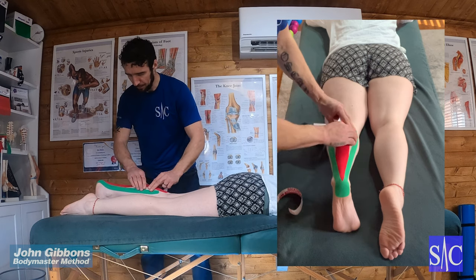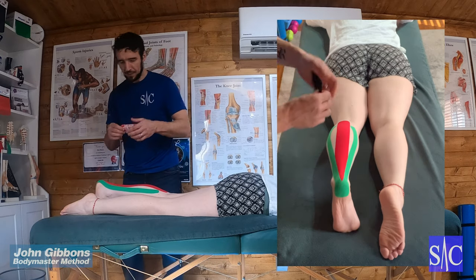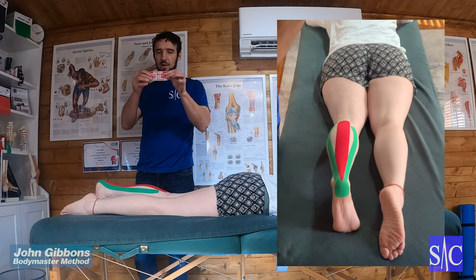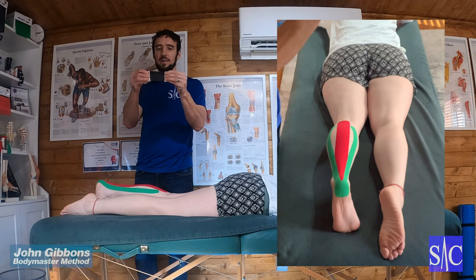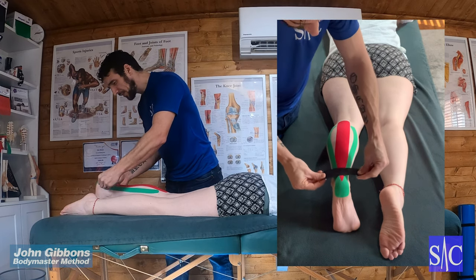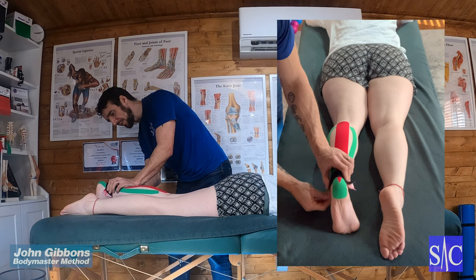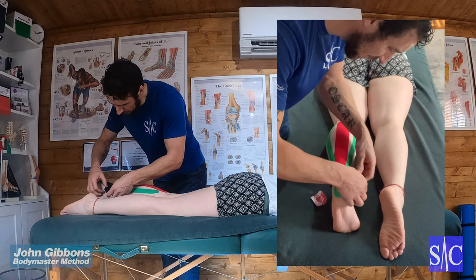For the final piece, tear straight down the middle, hold onto the ends and pull so the backing comes off. Flip it so you're holding the tape with the centre exposed. Pull it apart to 100% stretch, go straight onto the tendon, aiming to finish on the ankle bones — straight down over the top, lay it. At the end, as you pull off the tabs, no stretch at all. So 100% over the tendon, then nothing as you lay it down.